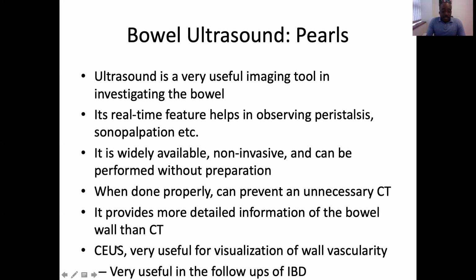Lastly here, contrast-enhanced ultrasound is very useful for the visualization of wall vascularity, which is a very useful tool in the follow-ups of inflammatory bowel disease.